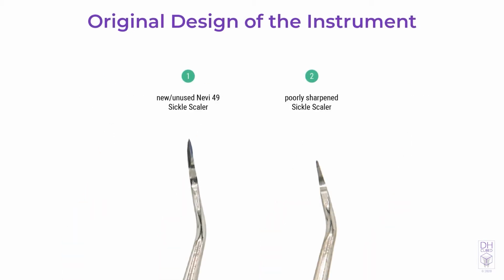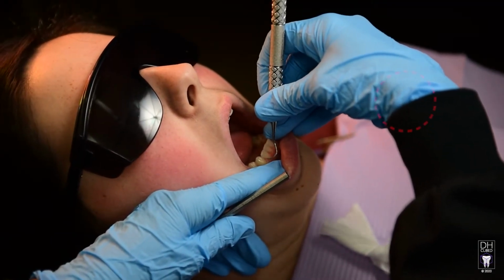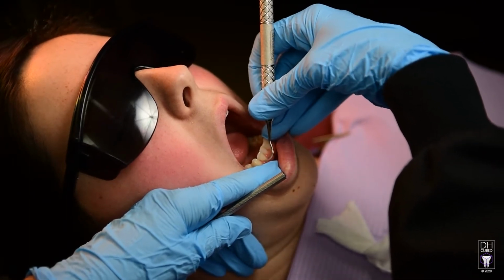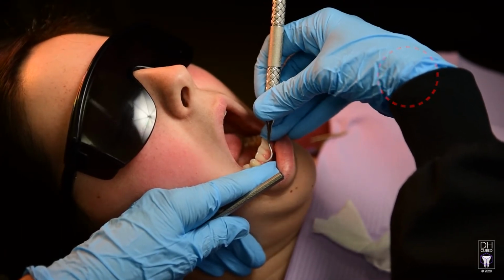There are several factors of how a poorly sharpened instrument affects the hygienist. 1 is causing bevels on the lateral surface. 2, working with a dull instrument, and 3, turning the stone in at the tip, causing the instrument to become short and ineffective in the interproximal. Notice how this hygienist's wrist is not neutral. She's trying to close the blade in the attempt to get the instrument to adapt and bite the tooth. This is either from bevels on the lateral surface and/or a dull cutting edge. This repeated action can lead to hand injury over time.